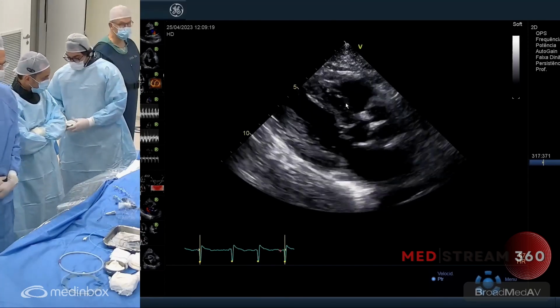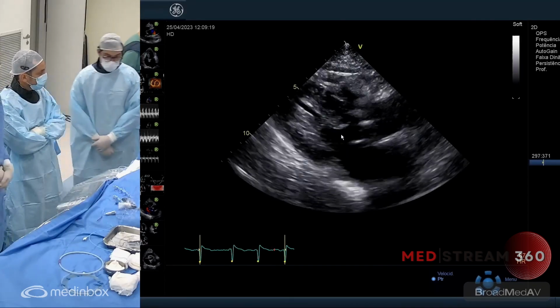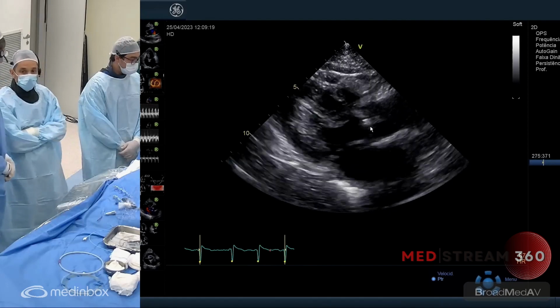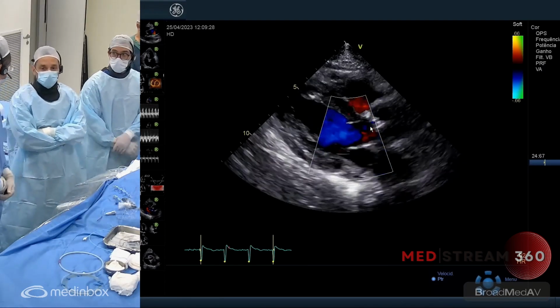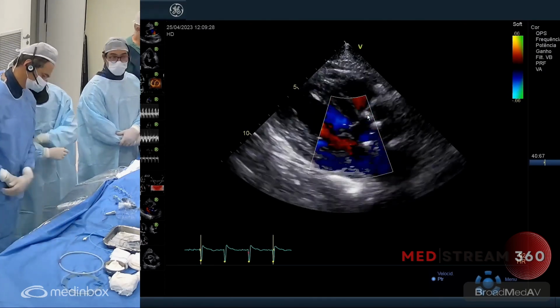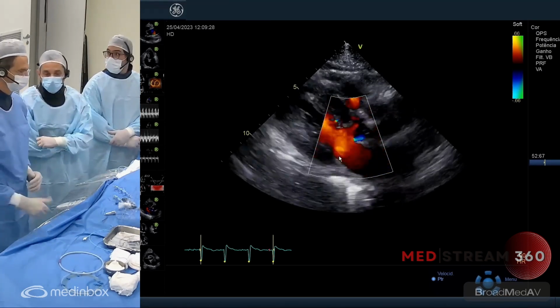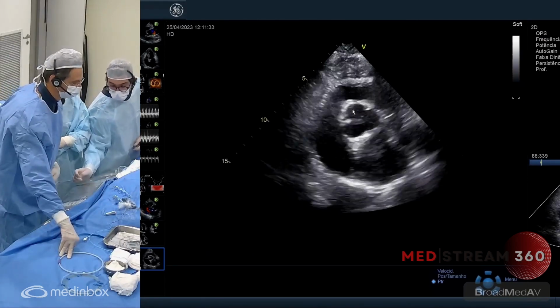We see the increase in myocardial thickness here, a small LV, as they said before, thickening of the whole aortic valve with just a reduction of the mobility here. Just using the Doppler imaging, we have a mild regurgitation on the aortic side, a trace on the mitral side, nothing significant. Apparently, the systolic function is preserved in both ventricles too.